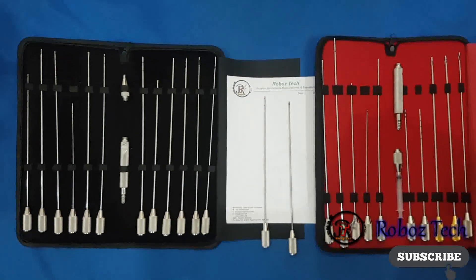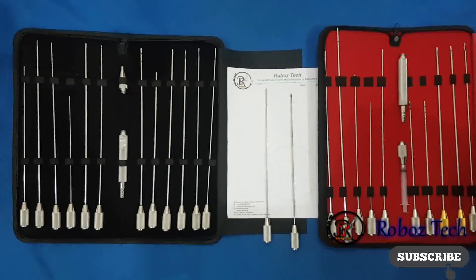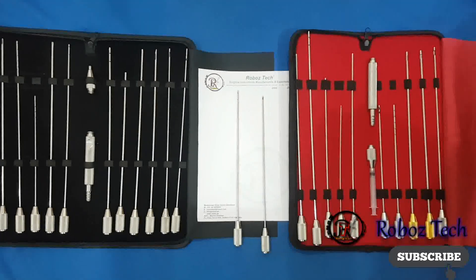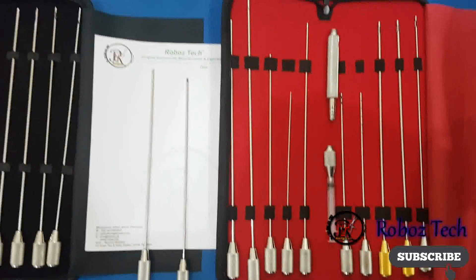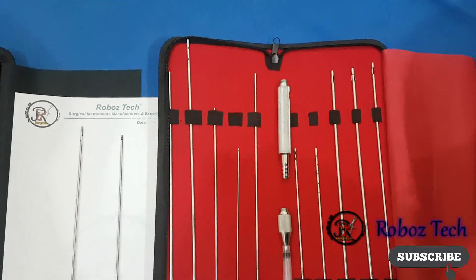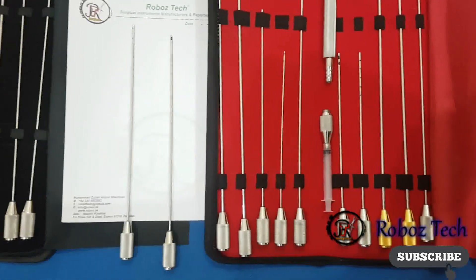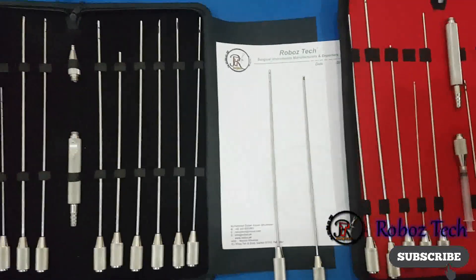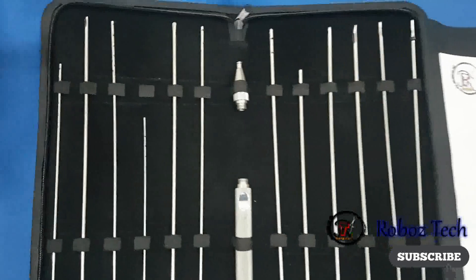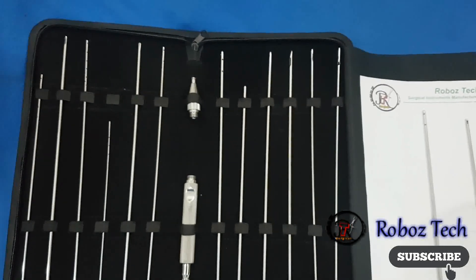We have quality instruments with a guarantee. If you feel any issue with our liposuction cannulas — like any damage — and you are not satisfied with the item, you can send us your feedback. We will work on your feedback and send you a free replacement instrument for the one that had an issue.